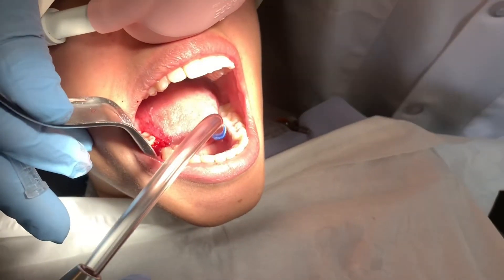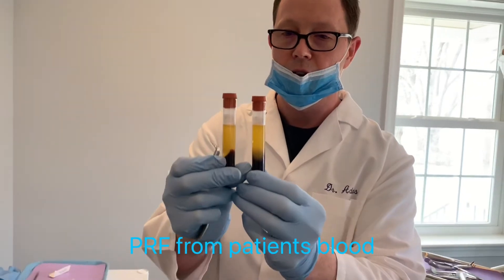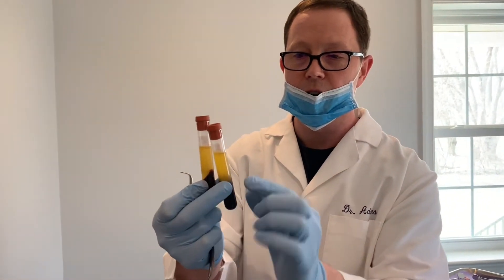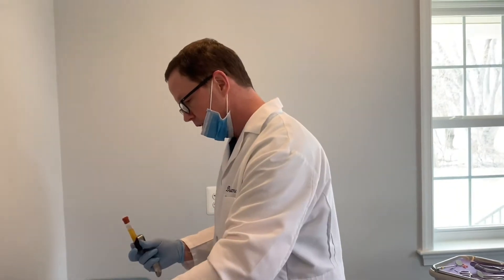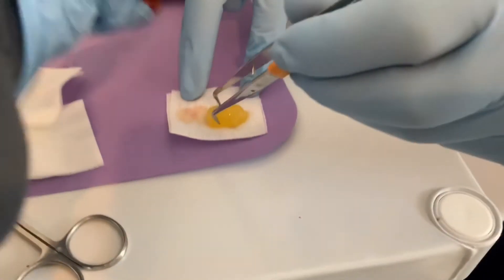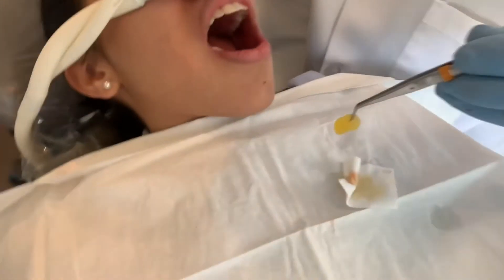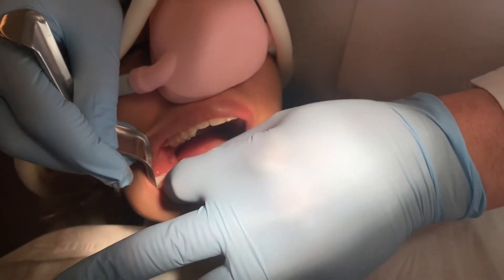The final thing that we do is put the platelet-rich fibrin in. These are the two vials of blood that we drew. You can see that there are two layers basically — the yellow layer on top and the red layer on the bottom. The yellow layer is essentially what we're after. It's a mixture of white blood cells, platelets, fibrin, and there's a lot of bone growth factors in there. We want to get the red part off. This stuff is very fluid.